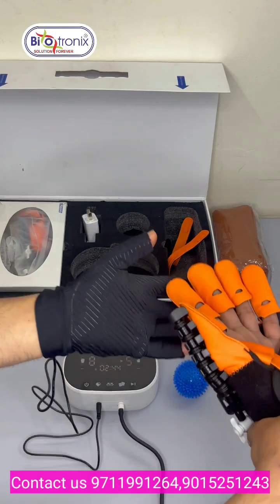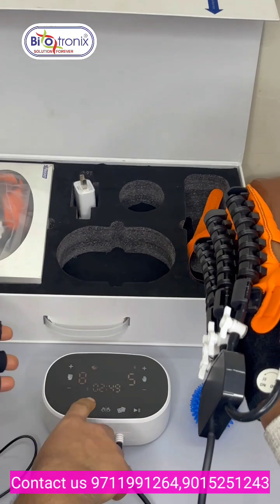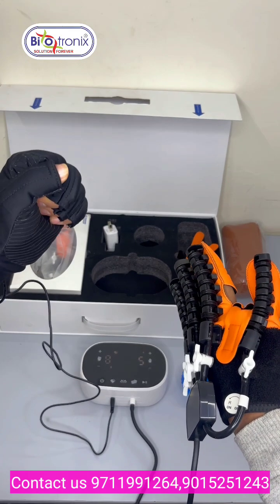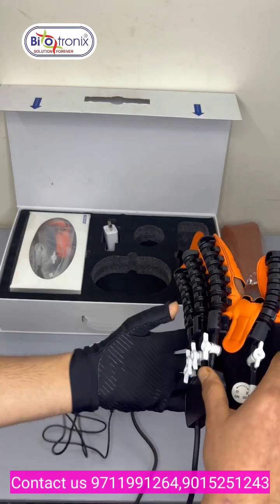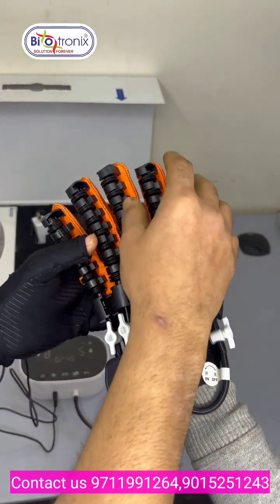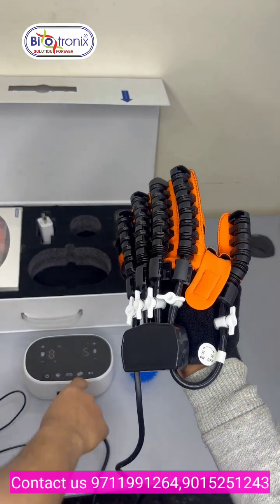And in the passive training mode, if I select the passive training mode, as you can see, the complete hand is getting flexion and extension simultaneously. But if you want some finger to stay closed, you just have to use these valves. If I don't want this finger to work, I can close the same, and then these three fingers and thumb will get extension and flexion, but that finger will remain the same. I will show you how.